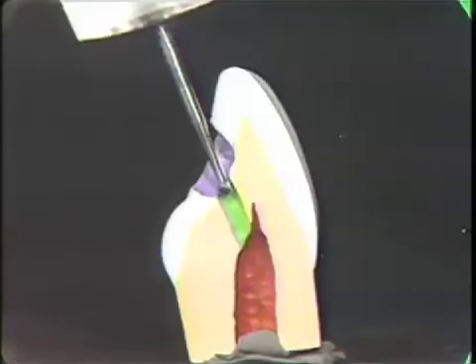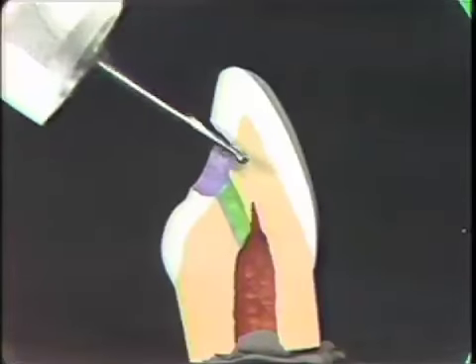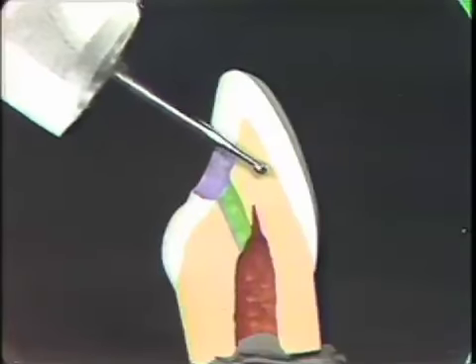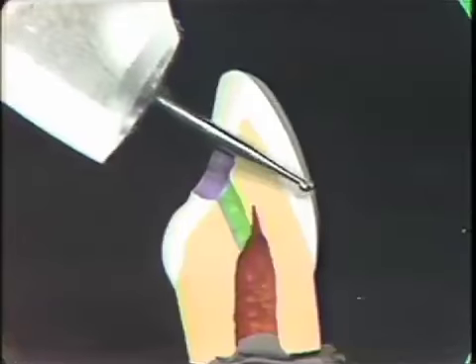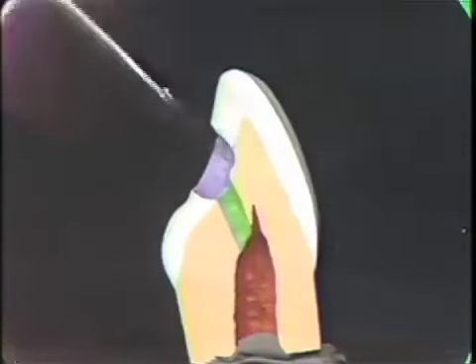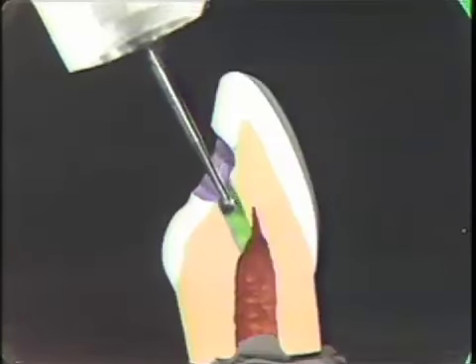Now, there are two ways where people get in trouble in this step. One is to start off in the wrong angulation. They keep it in the same angle that they kept the high speed, and they continue right on out, miss the pulp, and go right out the front of the tooth. Now, patients don't like you drilling holes in their teeth while you're looking for the pulp, so make sure and check your angulation so that you're in the proper long axis of the tooth and go right on down.